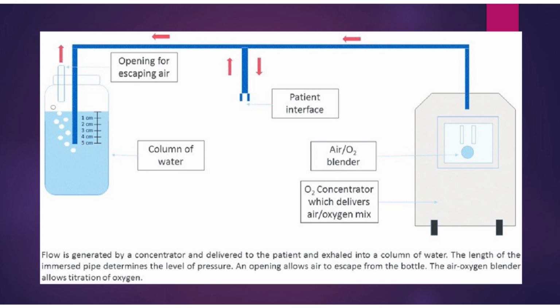Then on the left of the screen, you've got your pressure chamber, which hopefully is an approved one, so that we know that the pressure is actually what you're delivering. You can titrate that pressure to how the baby looks. If the baby has increasing signs of respiratory distress, you increase your pressure. If the baby has fewer signs of respiratory distress, you reduce your pressure. As we've said, we use the Downes score. You can just as well use the Silverman-Anderson score, or if you're in a high income setting, or very lucky here in Uganda, you can use your blood gases.